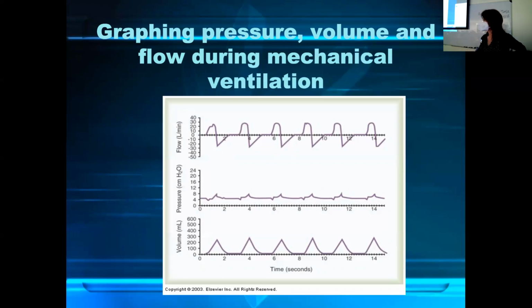There's the exhalation on the flow there, then you start at the very bottom part. Correct. So I was telling you how everything below this baseline is exhalation. Doesn't the exhalation start right after peak pressure, like at the top of the waveform?